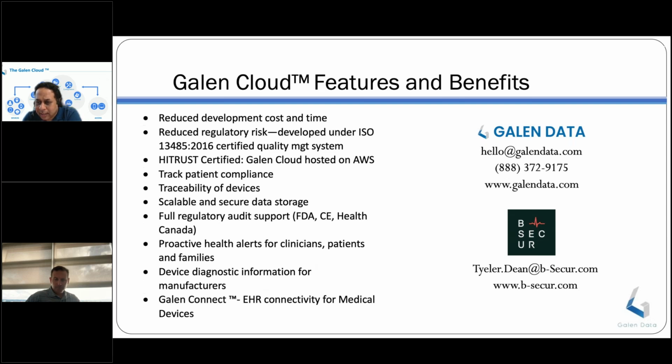What does it mean that your ECG algorithms are cleared? Does it mean that the FDA approves for a specific indication of use? Can you explain what your FDA clearance scope is, I guess? Yes. So how I'm interpreting the question: our FDA clearance is software as a medical device. So someone looking to have their hardware cleared, and looking to have ECG within it, this becomes basically the software that is the predicate as well as approved. So it shortens that regulatory pathway for a new organization, or maybe if they're going to a Gen 2 device.